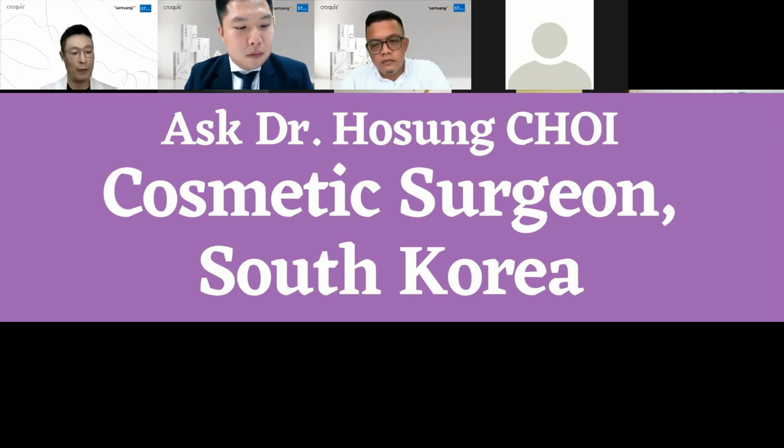So I recommend another touch-up procedure after 1 month, but within 3 months. If the patient's compliance is good, then I would recommend a touch-up 1 month after the first treatment, adding maybe half the number of threads compared to the first treatment. And then I think good results will last more than 8 months.